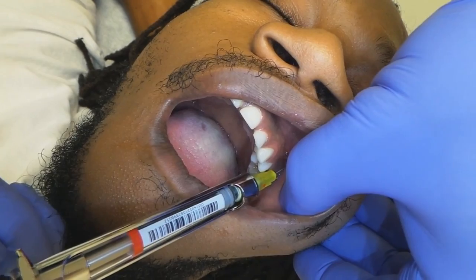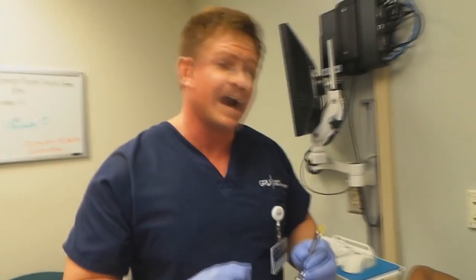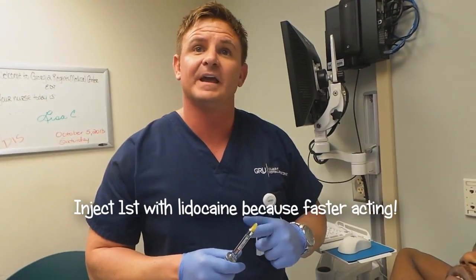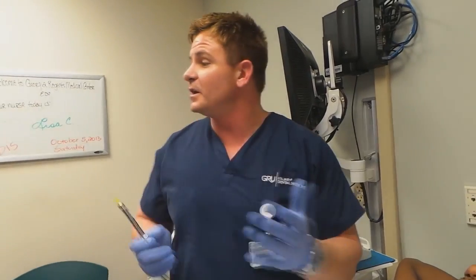If you like your patient, go in with the lidocaine first, because it's really fast acting. Carbocaine is the fastest, but if you come in with lidocaine you'll get it numb faster. Then you're going to come back with marcaine, which is bupivacaine — it has a longer duration, but takes much longer to set in. So once he's numb in that area, I'm going to come back with bupivacaine and give him a block with that.